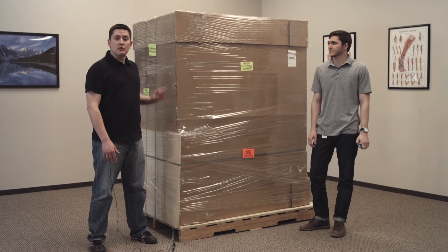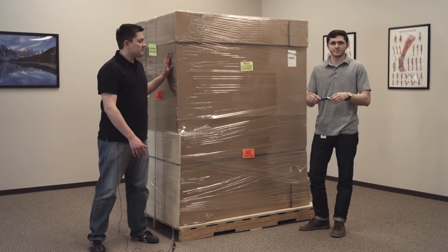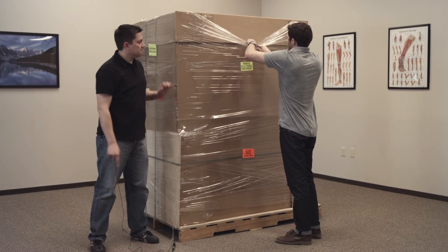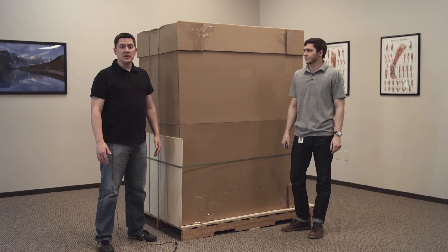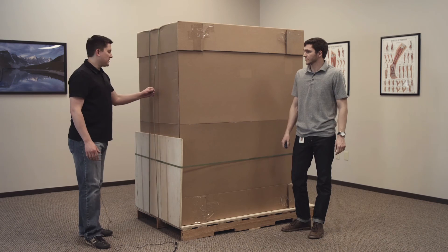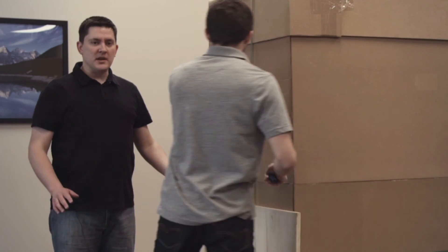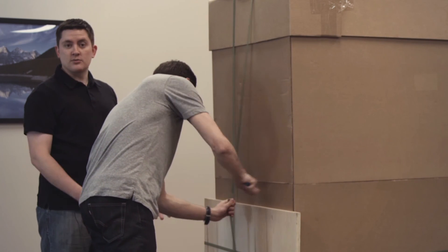First step is to remove all the plastic that's on the crate. You're going to use a box cutter and you're going to make a cut from the very top of the box all the way to the bottom. Now that the plastic has been removed, we're going to cut these green straps that are going over the top and all the way around the crate.